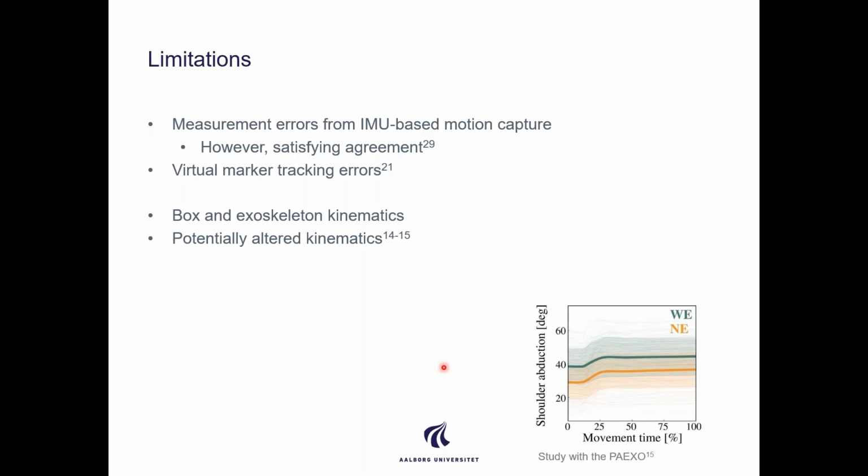However, when we wanted to perform this parameter variation, it was not feasible to have a subject perform 4 lifting tasks with an exoskeleton at 25 different settings. So we did not do that. And we also wanted to make a method that was feasible to go out to the factory with just a simple IMU-based system and then perform the analysis at home.